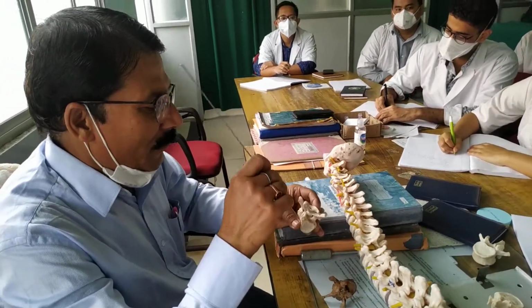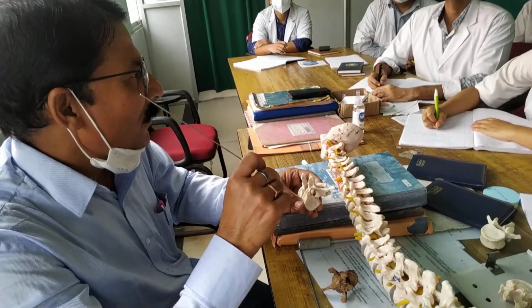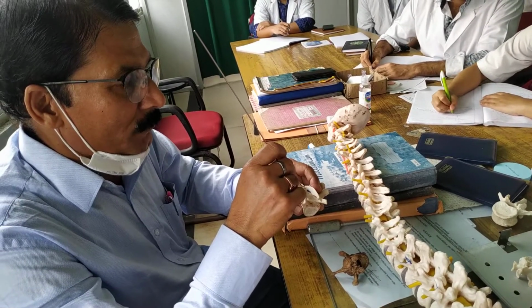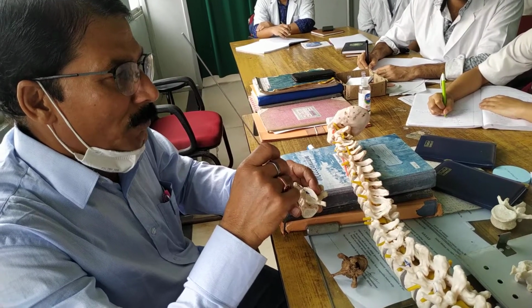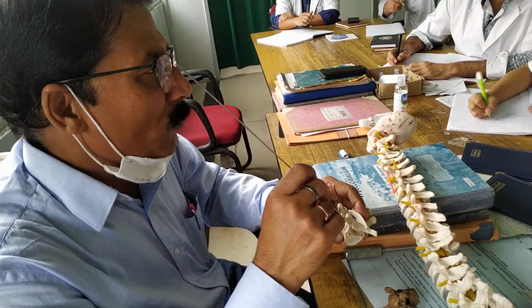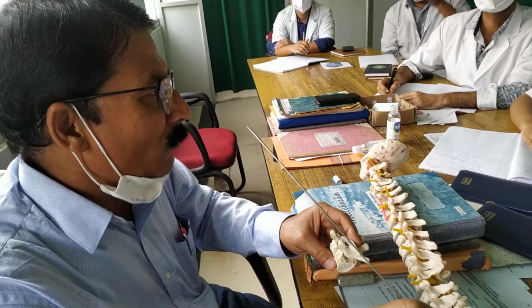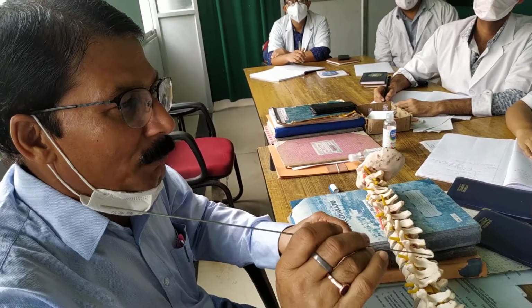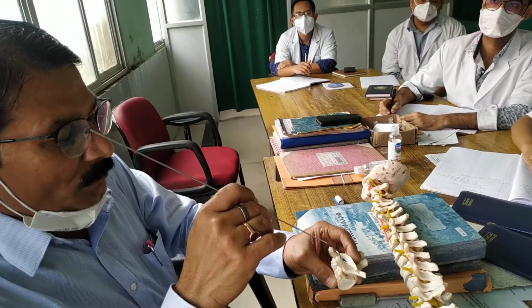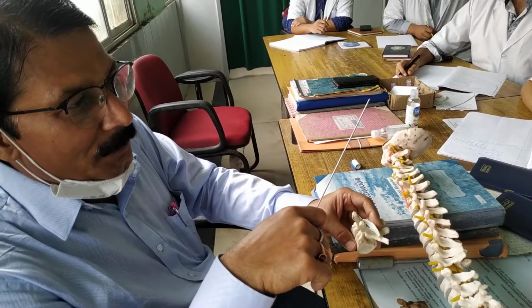So lengthwise, as I told you, you should not go beyond the distal 1/3. It should always be the proximal 2/3. Limit yourself and do not go beyond that, because you do not need bicortical fixation. In the case of a pedicle screw, it is only needed for the sacral vertebra, where you need to go for bicortical fixation up to the sacral promontory. But here you do not need it. So this is unicortical, go up to that, then we do the fixation with the rod.